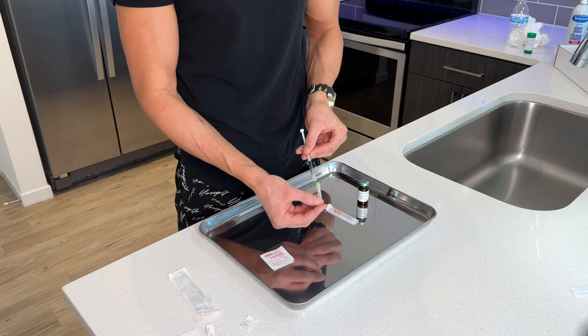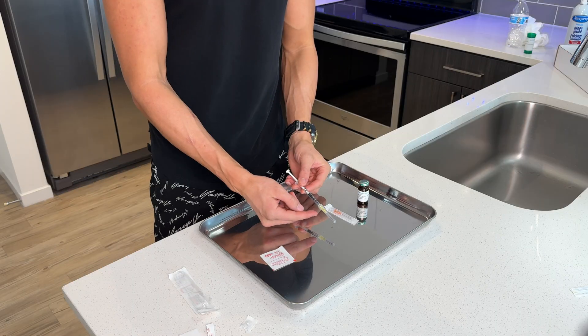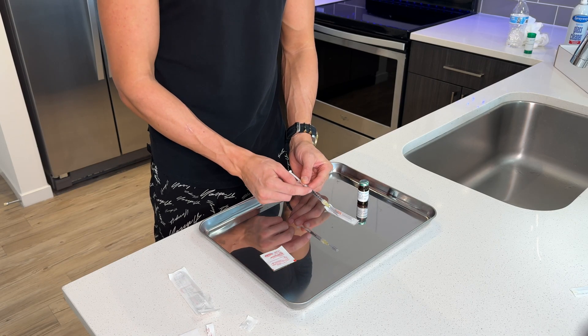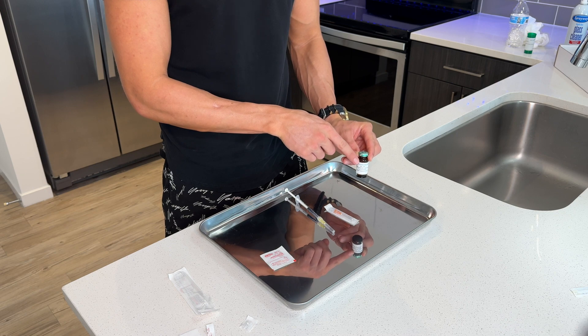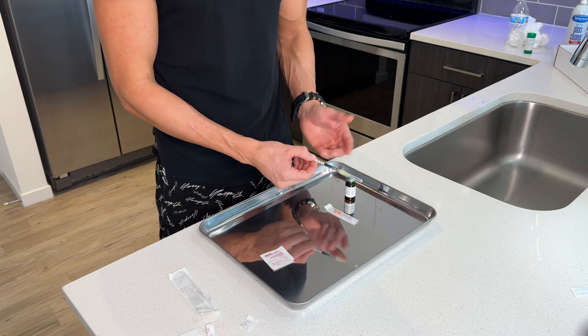Almost all clinics are gonna give you a screw-on needle, so all you have to do is put it in and screw it to the right. Now remember, we've already pulled back the syringe to the 0.5 mark, which means the syringe is filled with air right now. A vial of testosterone is inside of a vacuum seal, which means if you're gonna draw testosterone out, you need to put in an equal amount of air to equalize the pressure inside of the bottle. So we're gonna go ahead and do that now.